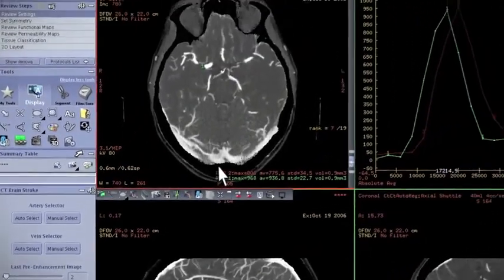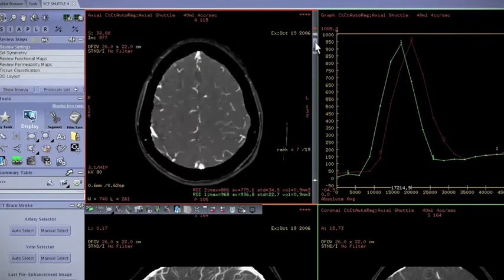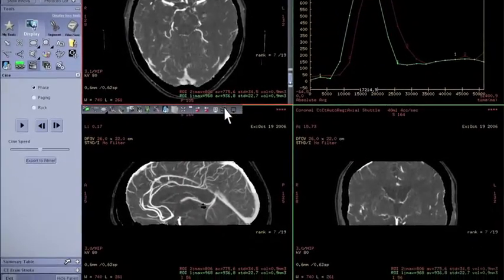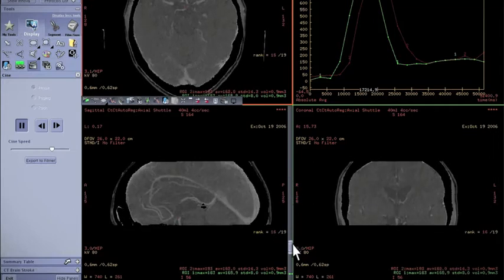In the meantime, you can see the application has automatically used the digital subtraction angiography algorithm to remove the bone structure, allowing us a much cleaner visualization of the brain tissue. Now we can smoothly page through the volume. With the Cine mode applied to the selected slice, I can check the contrast media arriving in the brain and then the flush.